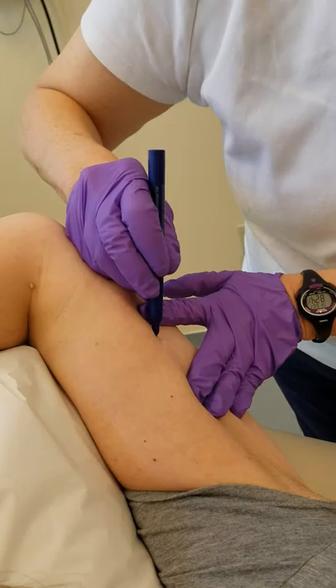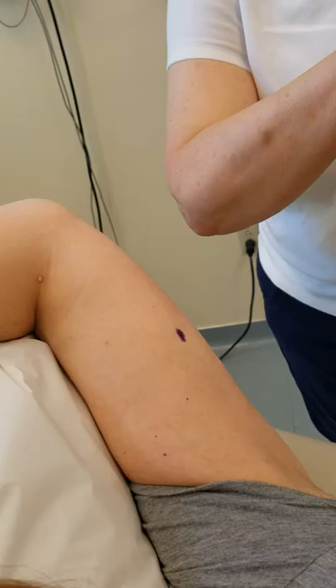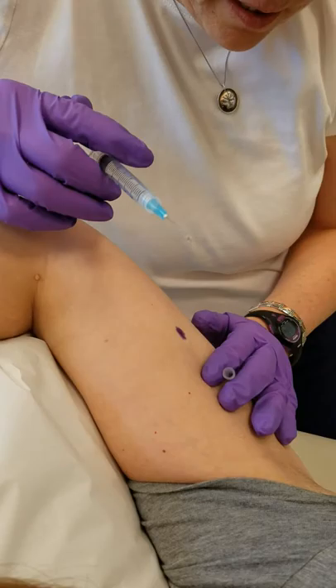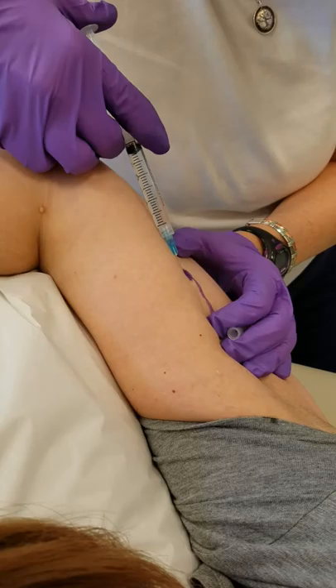It starts just the same as you might expect — you mark where that Nexplanon is and then you're going to put a little lidocaine in. What's going to be different about this is we're going to use a biopsy punch to make the opening. We're applying just a little traction on the proximal end of this Nexplanon and putting in a little lidocaine.